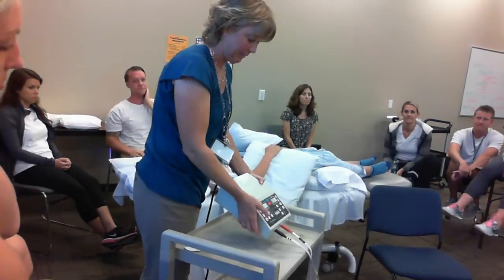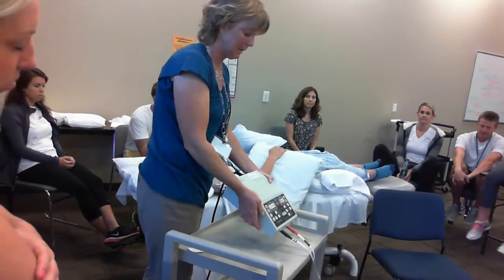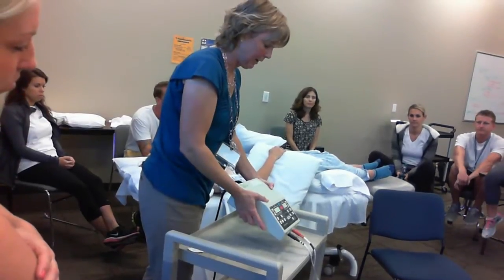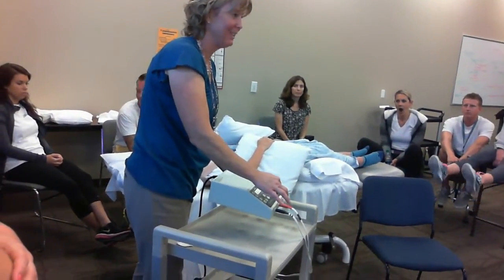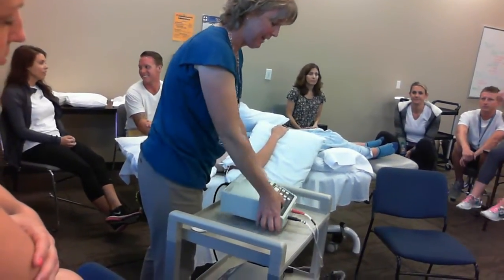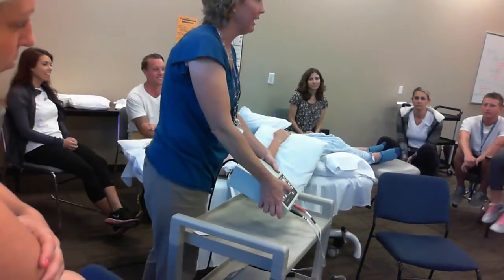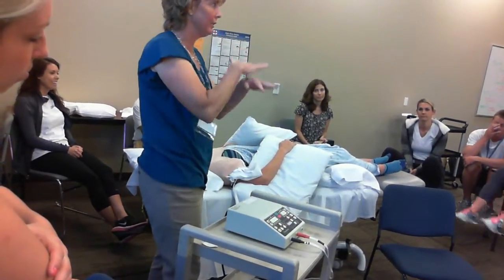So time over here, typical treatment time is 15 to 20 minutes. I'll set it at 15. And now the only other thing that I can play with is down here where it says scan or sweep. Remember those? So if I hit the button once, nothing's lit up. That's true or static interferential, which means wherever they intersect, they intersect.